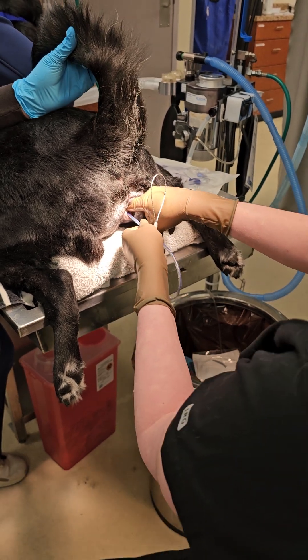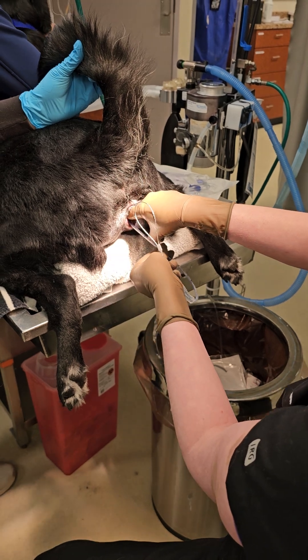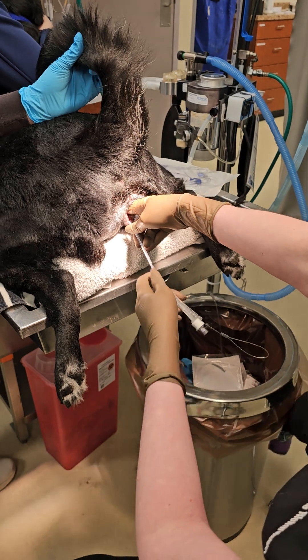When you're in the right spot, you should be able to feel a layer of tissue over the top of your urinary catheter. Then you're going to insert it the rest of the way.